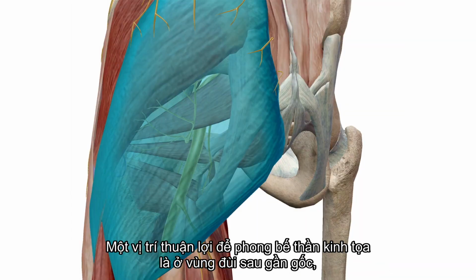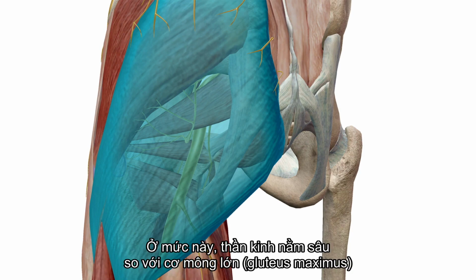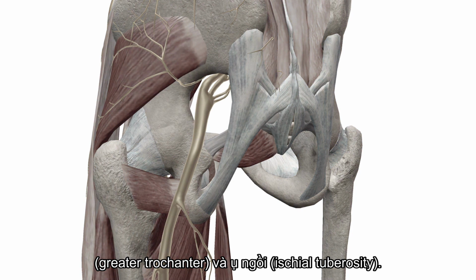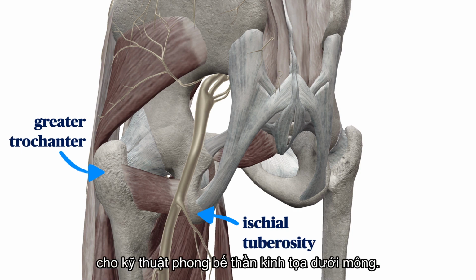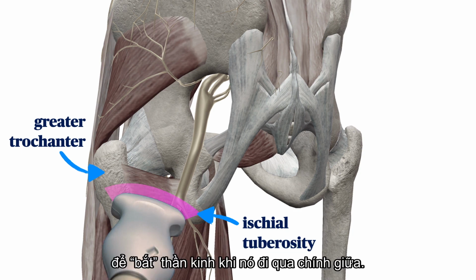A convenient place to block the sciatic is in the proximal posterior thigh, where it has a consistent relationship with the bony anatomy. At this level, the nerve is deep to the gluteus maximus muscle and superficial to the small quadratus femoris muscle, which is slung like a hammock between the greater trochanter of the femur and the ischial tuberosity. These two bony prominences are important surface landmarks for the subgluteal sciatic nerve block. We're going to place our ultrasound probe right between these to catch the nerve as it passes through the middle.